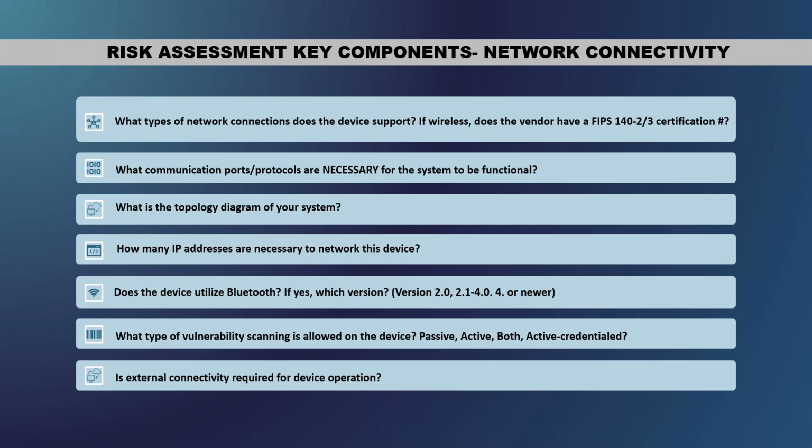And then the vulnerability scanning. This is also going to be a huge one, and we're going to talk a little more about it in a couple of slides. But you start asking them, for vulnerability scanning, can it do active? Can it do passive scanning? Can it do both? Is credential scanning allowed? A lot of medical systems cannot do credential scanning, so that's something you need to verify, as well as the external connectivity. How is the vendor going to access the medical equipment in your healthcare environment?